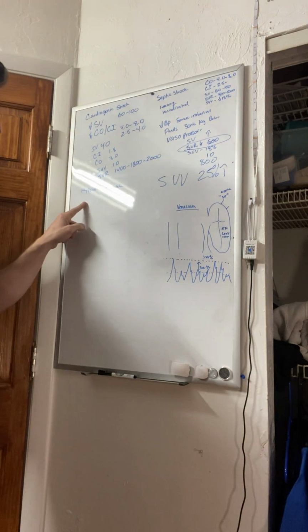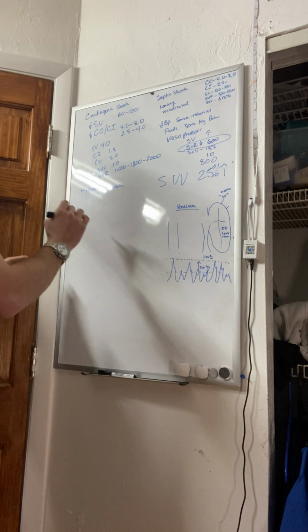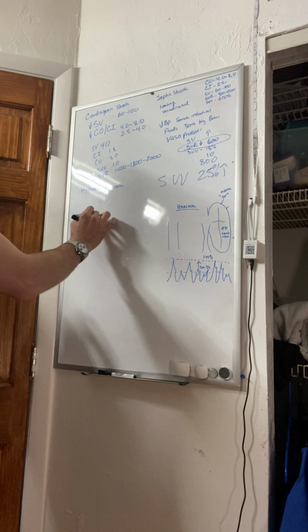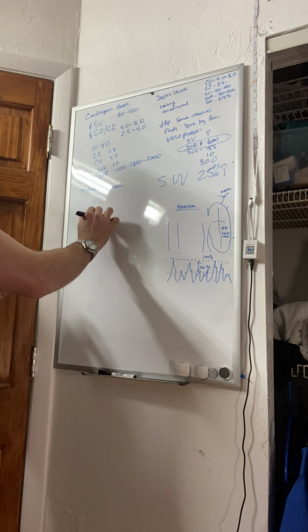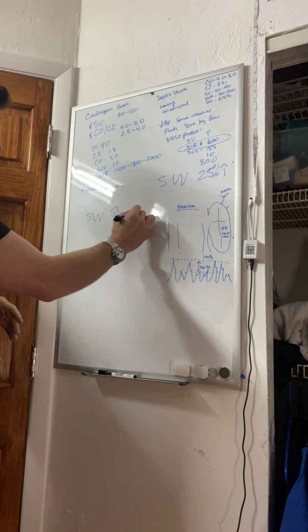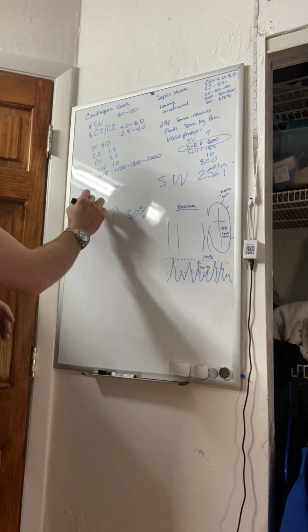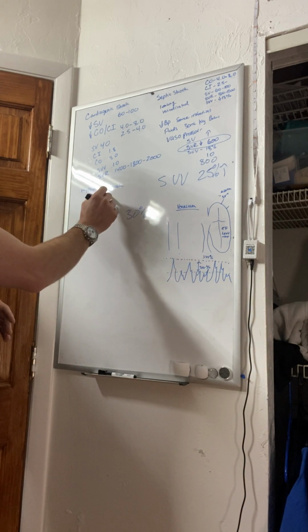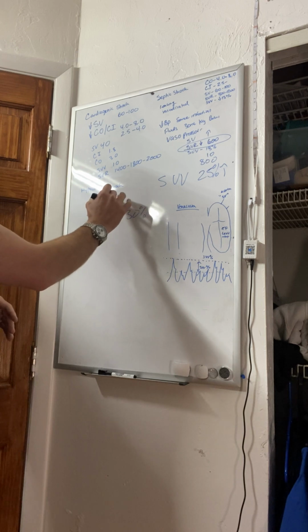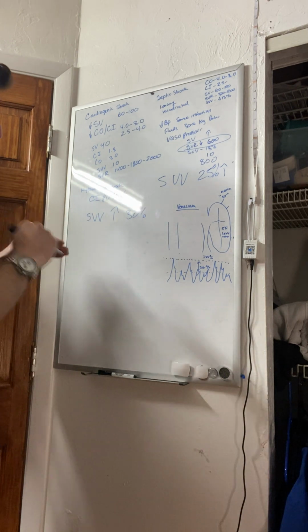So moving on to hypovolemic shock, it's basically SVV is high. High is dry, you'll hear that. That refers to SVV. Let's say it's 30%, because we have a high variation. And your cardiac index, output, and maybe even your stroke volume are on the border of low or normal.